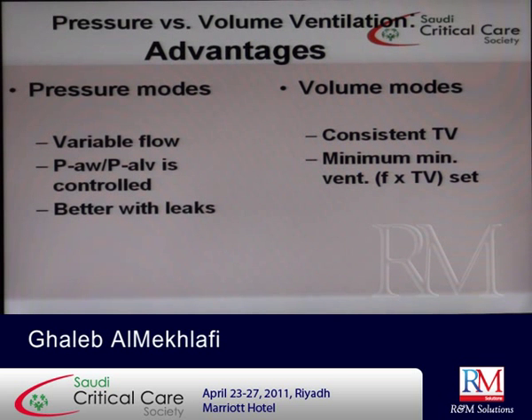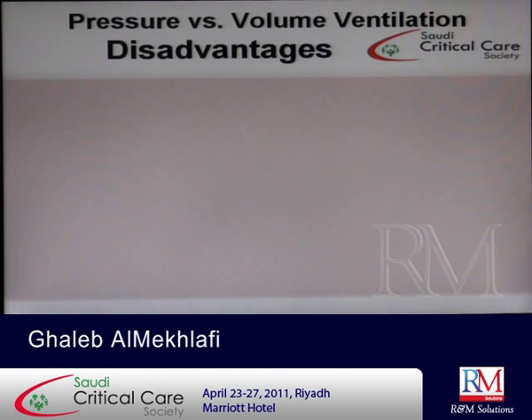Okay. And the minute ventilation will be delivered to the patient, and that minimum ventilation will be constantly given to the patient. In the pressure mode, I cannot ensure the volume, but I know that this patient is protected because he cannot exceed that level of pressure. Clear? So, in other words, in pressure modes, I can control the pressure so that pressure will not be exceeded, but I cannot control the volume. Okay? And in volume modes, I can control the volume so that this patient will get that volume, but I cannot control the pressure, and he may get problems from increasing pressure in the airways, and maybe he will get air leak or pneumothorax. What are the disadvantages?